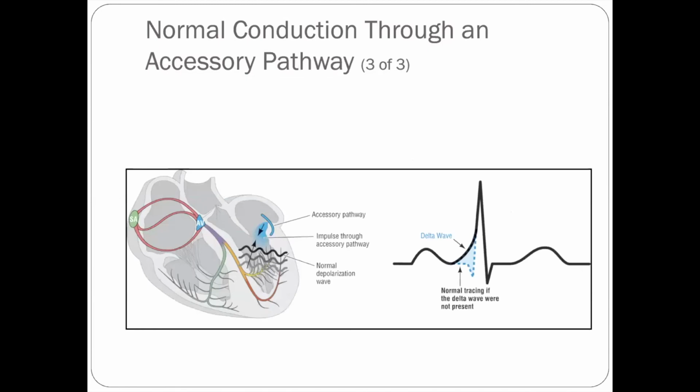And so you can see it here on this cartoon. You have the P wave followed by this beginning of cell-to-cell transmission within the ventricles, but then you get to the end of when the delay is done and the signal is through the Purkinje fibers, so everything else looks normal and depolarizes properly. And on the cartoon over here, you can see the AV node is currently delaying while this bypass track has allowed the signal through. So it starts going cell to cell, but it's completed in the normal fashion.